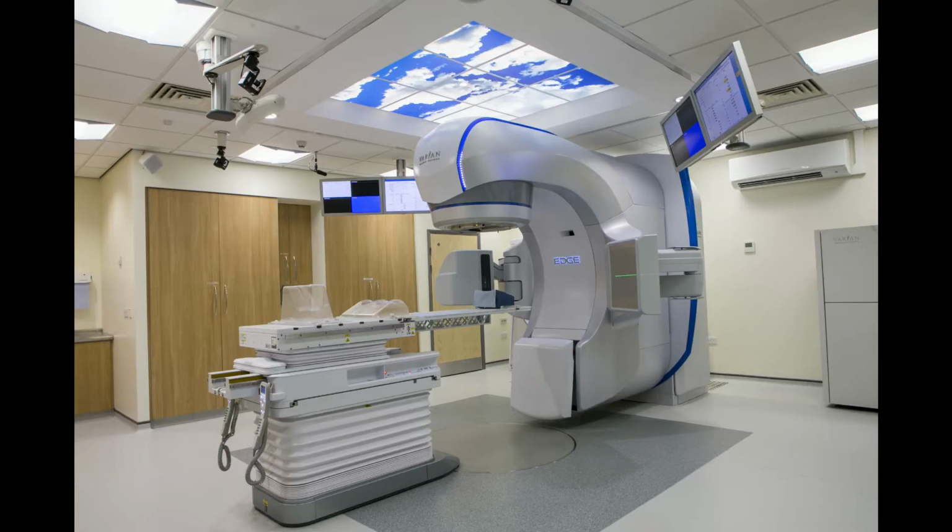When you attend for your radiotherapy treatment, the therapy radiographers will operate the treatment machine and they will explain to you what is going to happen and what is going to take place within the treatment room. You will be asked to remove any clothes and jewellery that may be covering the area that you are having treatment. The therapy radiographers will help you onto the treatment bed, position your mask and adjust the bed and align the machine into the exact position that is required. You will be asked to keep as still as possible.